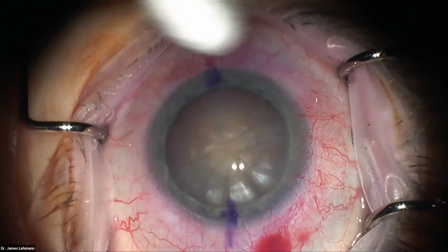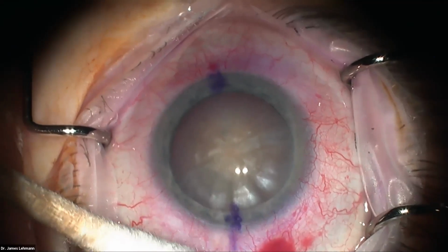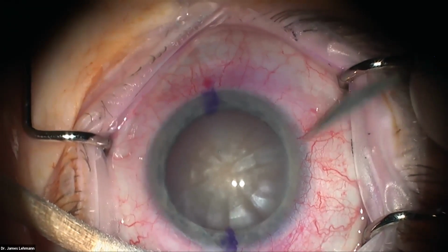But basically, it's a mature cataract, and these mature cataracts can come in two flavors. They can be soft and feathery, or they can be dense. And when they have a little yellowish tint like this, you can know they're kind of dense.